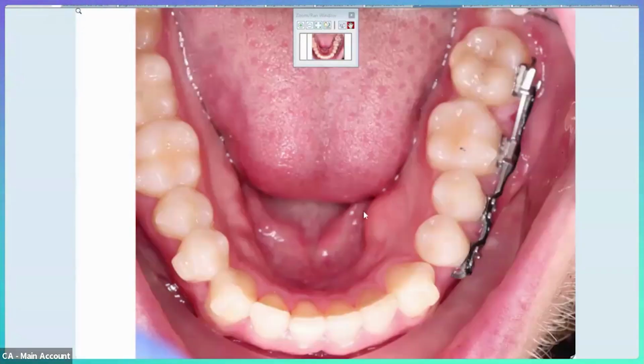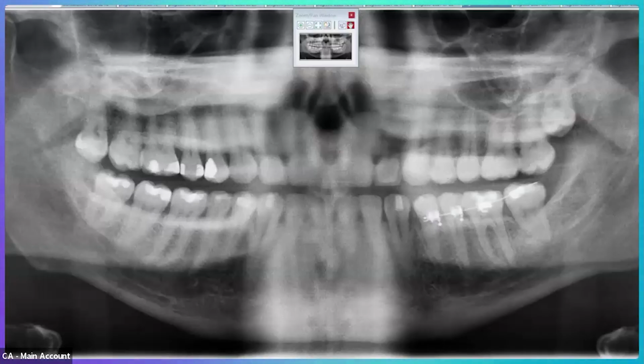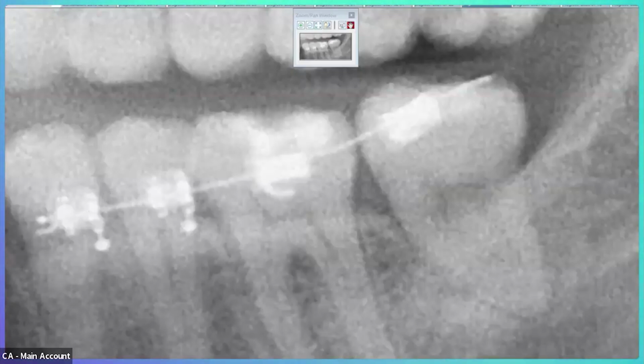You're going to see two things, but let me find my X-ray because it shows it better than anything else, is how I position the bracket on this tooth. So on these 3 teeth, we're just placing the brackets right on the gum line. There's nothing crazy going on with it. It's pretty straightforward and easy.